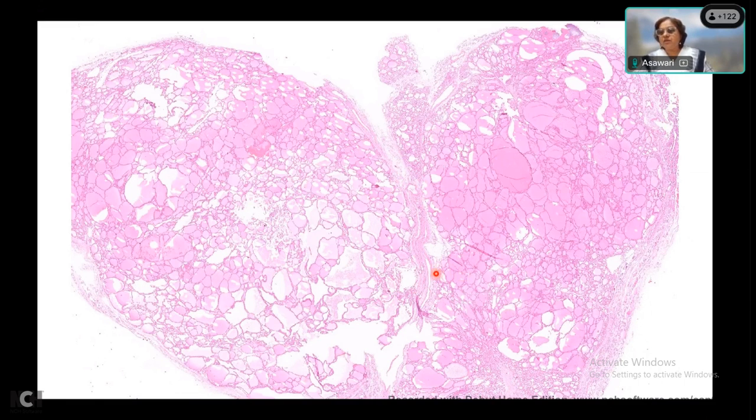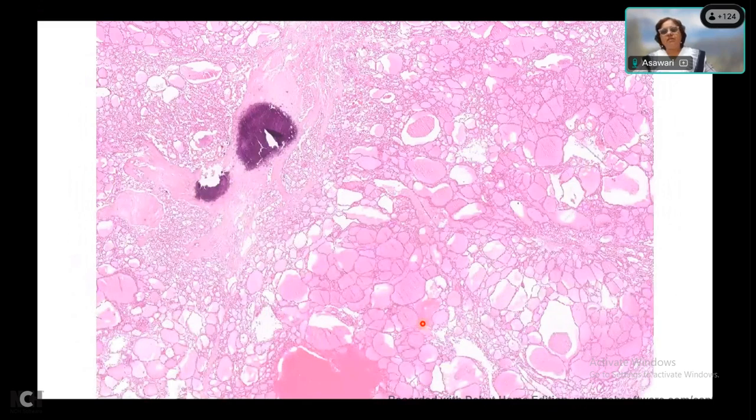Anyone want to volunteer? Ma'am, the lesion is diffuse in nature. There is no such capsule within the thyroid itself. It is the capsule of the thyroid gland that we can see in this section. I agree with you. So we do have some fibrous band which is dividing the thyroid parenchyma into multiple nodules, right? Okay, go ahead, Manasi or Apurva, any one of you can go ahead with the rest.